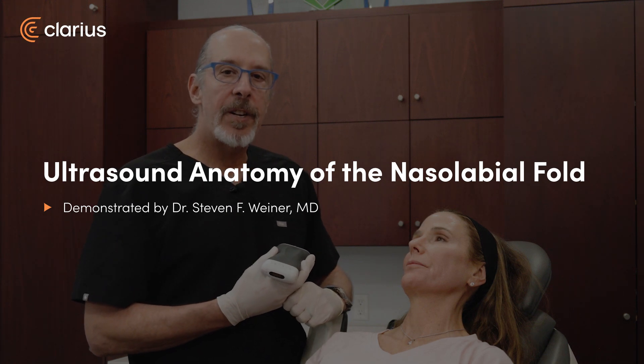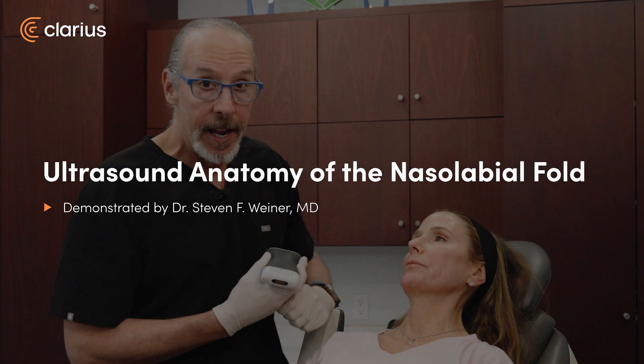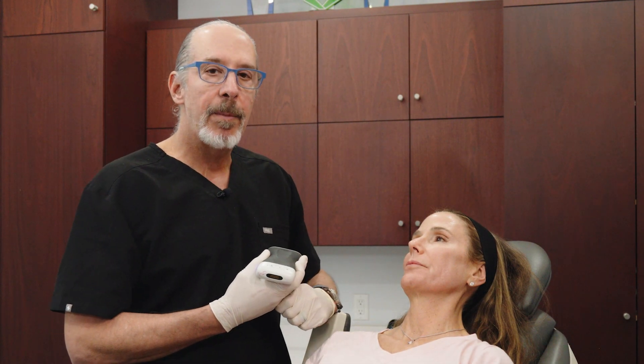This is Dr. Steve Weiner, and the next area we're examining is the nasolabial fold, the angular artery, and the deep piriform space.